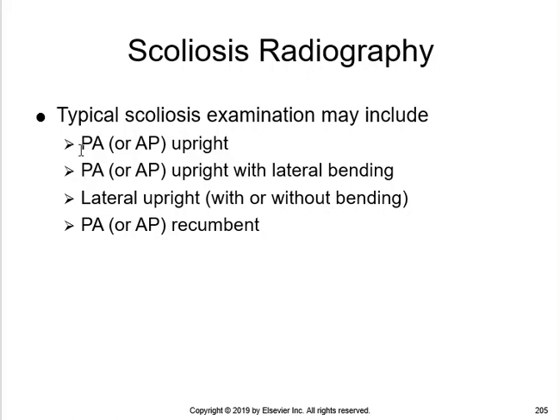So you can shoot in PA or AP. We prefer PA because in the PA projection, the central ray passes through the patient's body, and the body acts as a filter before the X-ray beam gets to the patient's breasts. So again, we're talking about little girls to young women that we're shooting, and the breast tissue is very sensitive to radiation, so we want to shoot PA. We want to do whatever we can to save some of that breast dose.